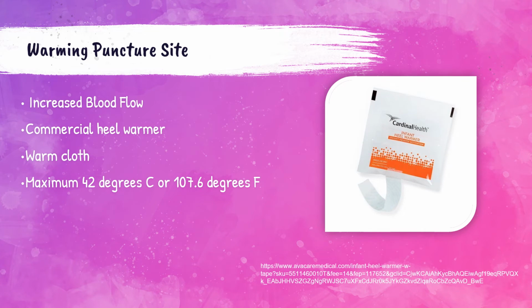Warming the puncture site increases blood flow significantly. If the phlebotomist does not have a commercial heel warmer, like the one pictured on this slide, the phlebotomist can use a glove filled with warm water or a warm cloth. The temperature of it should not exceed 42 degrees centigrade or Celsius, which converted to Fahrenheit would be 107.6 degrees Fahrenheit. In general, if it feels too hot for the phlebotomist, then it is too hot for the patient.